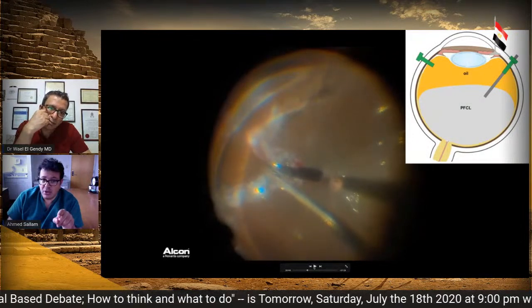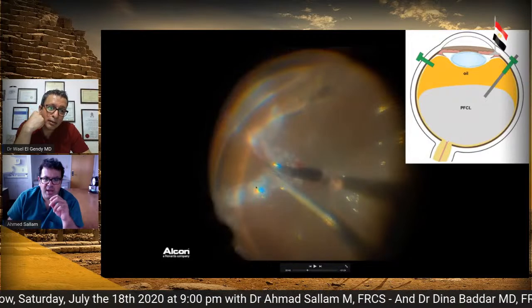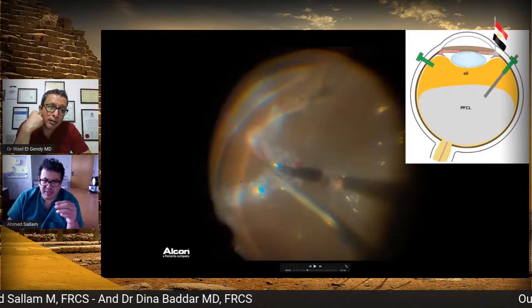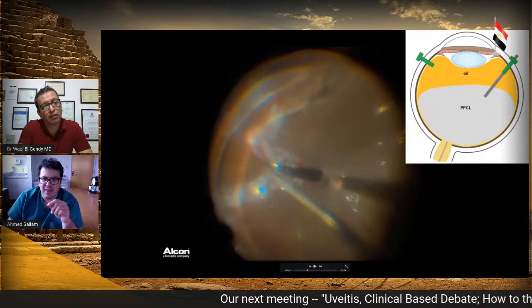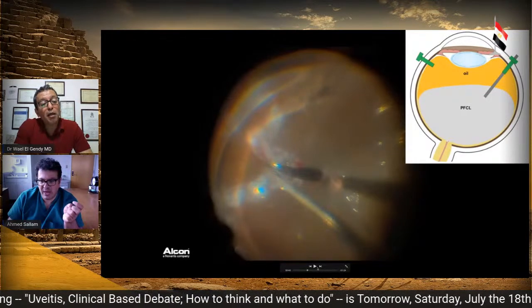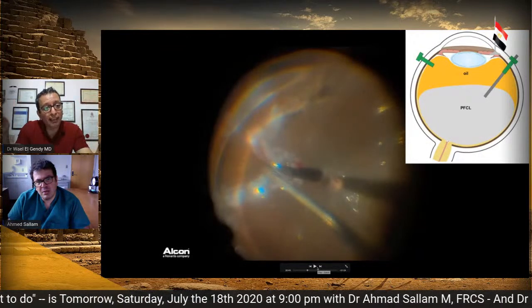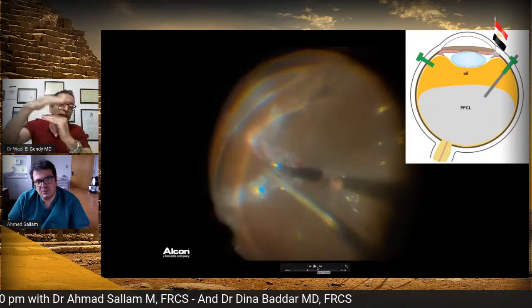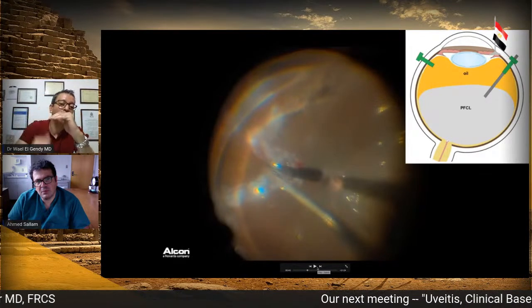And it's a very good point, Wael. I had not noticed why. I know that this is BSS, but I did not really know that it's like a darker ring around it. But you can see here, this is the PFCL and this is the BSS as a darker ring around it. Why is it dark again? Because it has a steep angle. The angle is very steep, so there's a shadow, the light is being deflected from the surface of the side of the bubble, the PFC bubble.